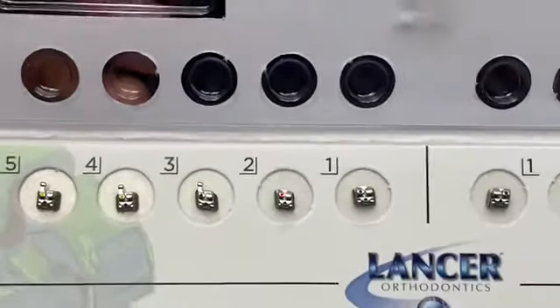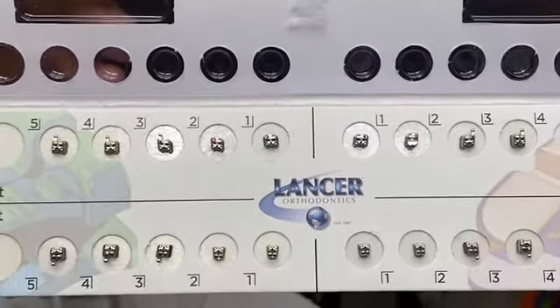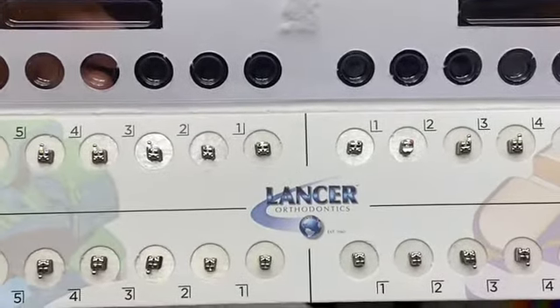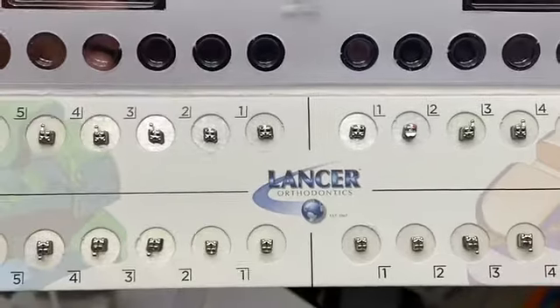here is how the sample package comes — as a set of 10: 5 on upper right, 5 on upper left, and so on, bottom right, bottom left.